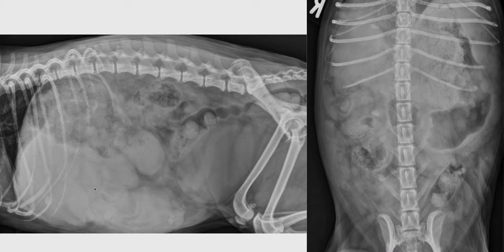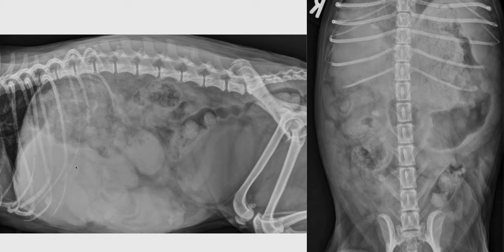Considering the differential diagnosis for those lesions, the most common thing that can create a cranial dorsal displacement of the stomach like this is usually an enlargement from the liver — either a diffuse hepatomegaly or a mass lesion coming from the liver. Less commonly, it could be a mass coming from the gastric wall itself, an eccentric gastric mass like a leiomyosarcoma or leiomyoma, but that's less common than a hepatic mass.